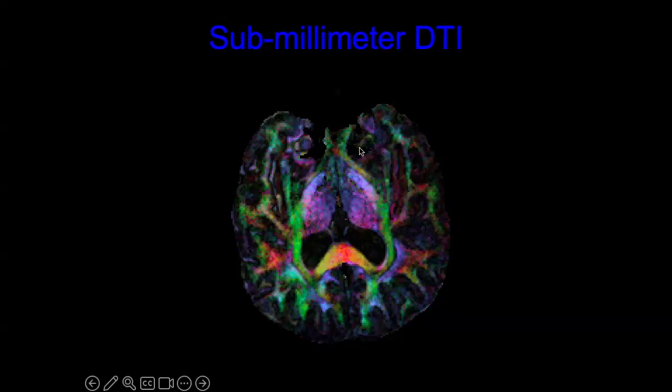But you can see, if you're familiar with the optic system, so you got your optic nerves, and the two main optic nerves cross right here in the middle of the optic chiasm. And at this resolution, we're actually able to resolve that crossing still using DTI.